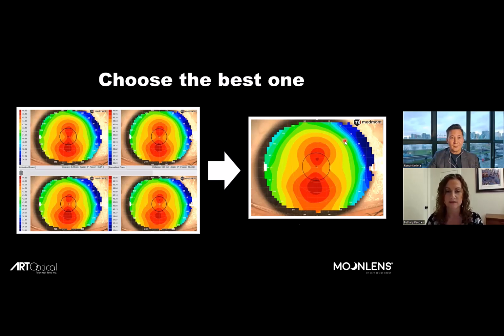And we get a few, maybe a couple weeks in, or we're a couple lenses in, and you're like, oh, I really think it's from that baseline. Well, now we have to discontinue lens wear and have them wash out. And that's really not a fun option either. So I think it's super important.